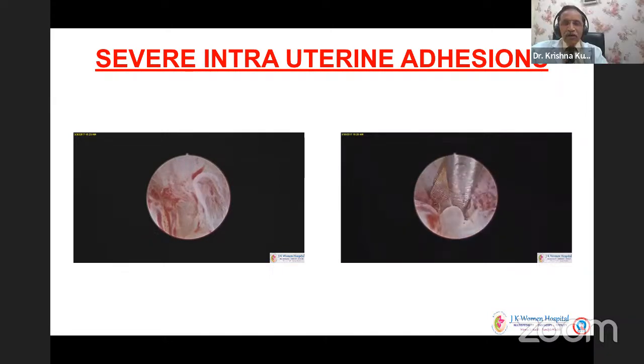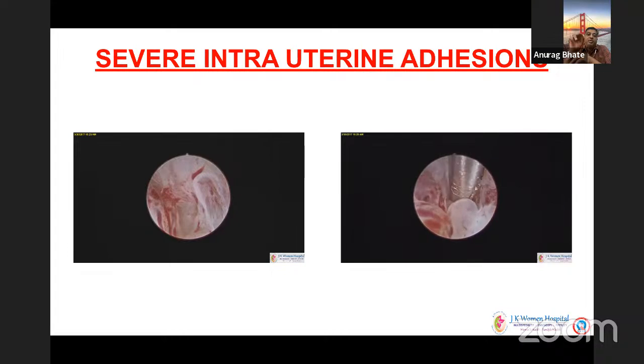That's fine. You don't have to cut even with the scissor. You can just go a little bit, keep on opening the scissor, and you might find the cavity.